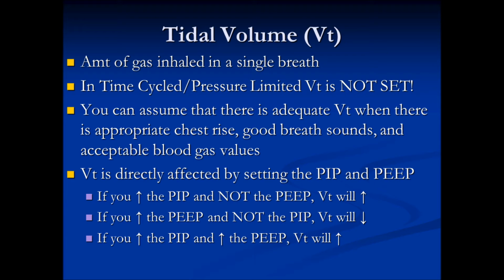Concept's still the same. So you can assume that there is adequate tidal volume when there is appropriate chest rise. So although you're not setting tidal volume, you're setting your PIP. We look at the chest rise to determine if the patient is getting a good tidal volume.